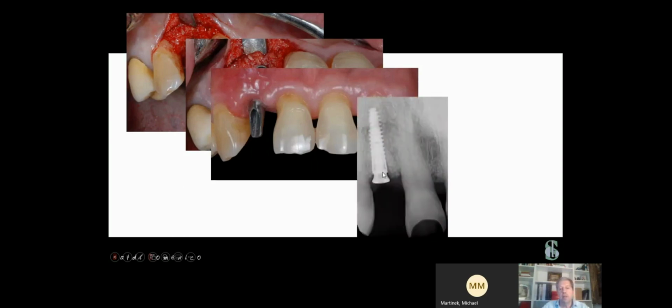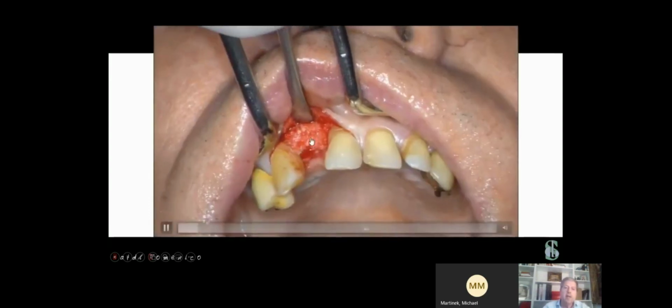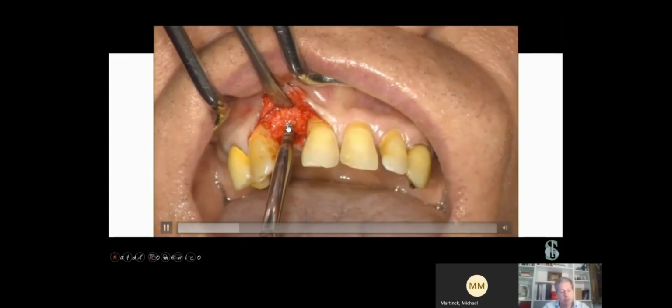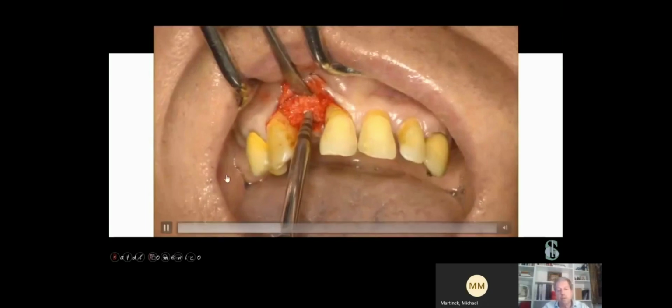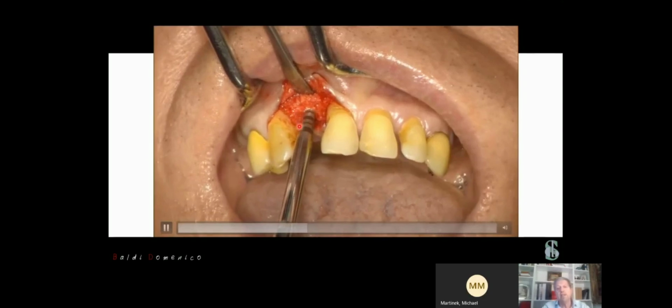We can finish our work. We can again transform our bone into a good quality, and we can finish our work. In this video, you can see our surgery directly, so you can understand that we made the extraction and we made a ridge preservation using a heterologous bone. Now it's necessary to prepare our implant site here. At the same time, we want to obtain osseodensification. And with the mallet, it's possible to obtain this. You can see how it's possible to manage our implant site preparation.